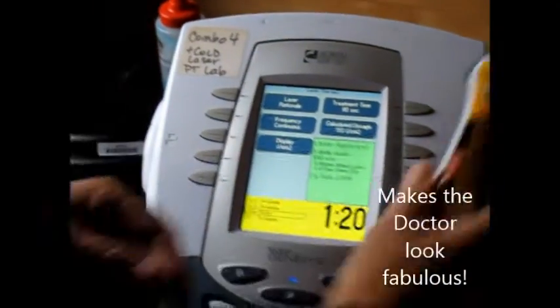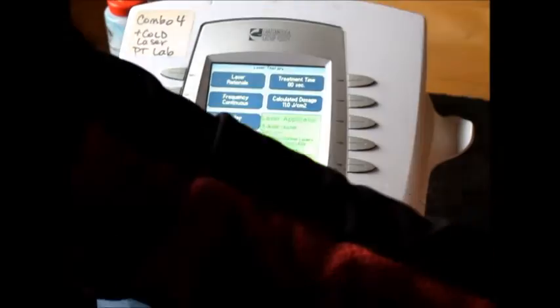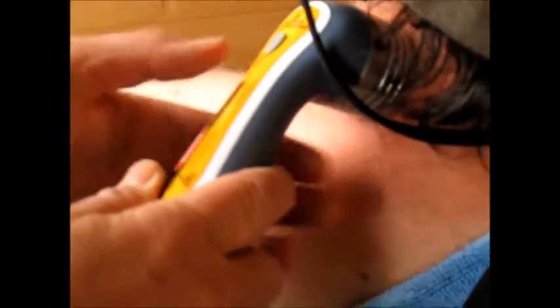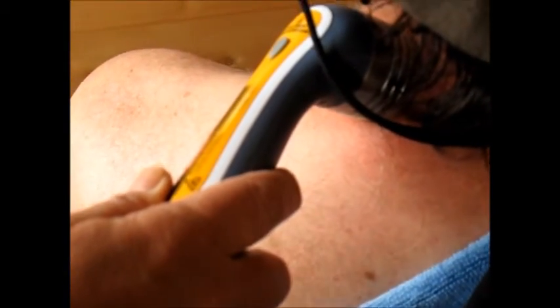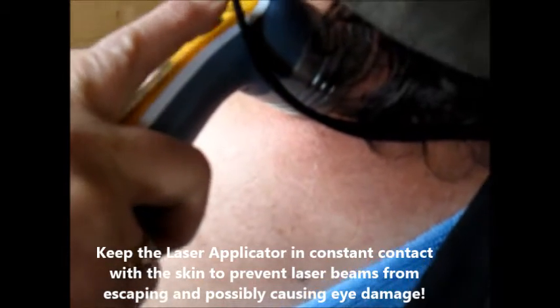Now I'm going to be doing the laser here. Arthritis was what we were treating, so I'm going to place it right where his arthritis of the neck is. Now you're going to see there's a lot of red coming out. I have to keep a good surface contact because if I pull away it could come off. So here we go, I'm going to hit start.